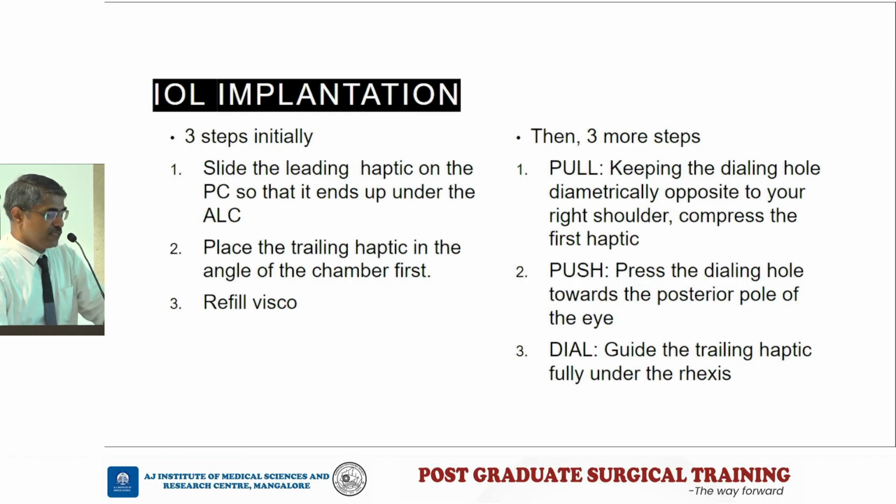So IOL implantation is the next thing which I thought I'll just tell you about. I wanted to talk about two things. One is the wound, the other is the capsule management. Making the wound, taking out the nucleus from the wound, making a rexis, and prolapsing the nucleus. There are two critical things where most of the time we get stuck.